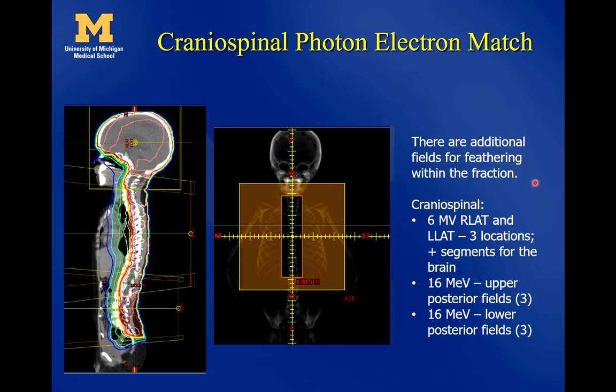And so a lot of times what we end up doing is shifting these. These days we're using a lot more VMAT, but some places still use photon-electron beam matching, and we'll end up shifting these beams relative to one another. So we'll take maybe this electron beam, and so that we don't get the over-under match, we may treat a field that's 20, and then we'll bump it out to 22 and then maybe 24 to fit it within a 25 cone.